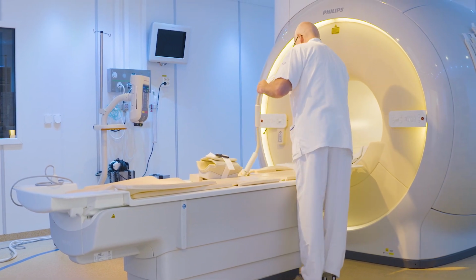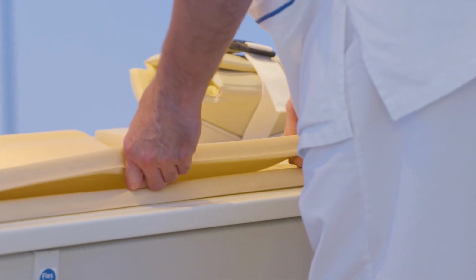Like in a child, the white matter develops with age. Myelination happens as the child grows. There might be some situations where we are unsure whether it is normal or not.